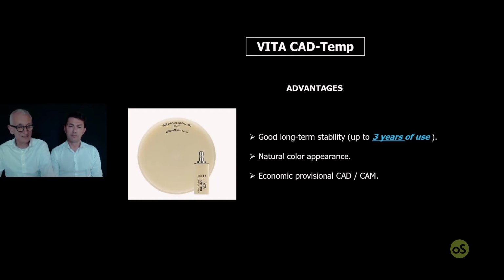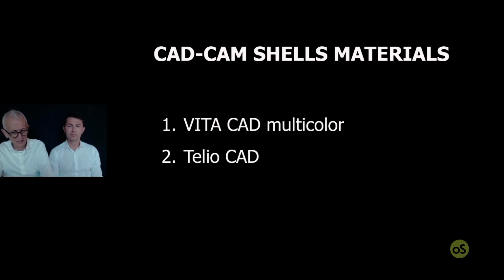This is why the company suggests the use for this material just for some years, not more than 3 years. So these are basically more addressed to make temporaries than final bridge.